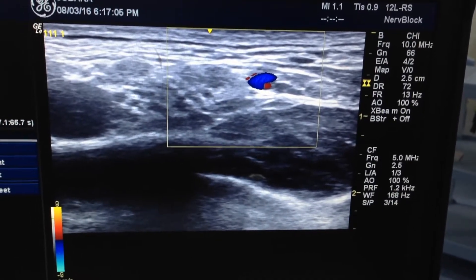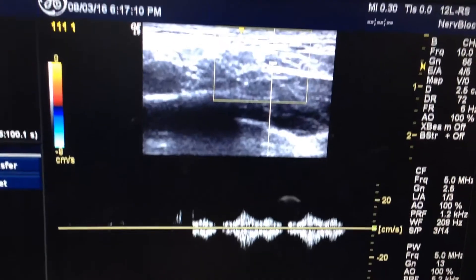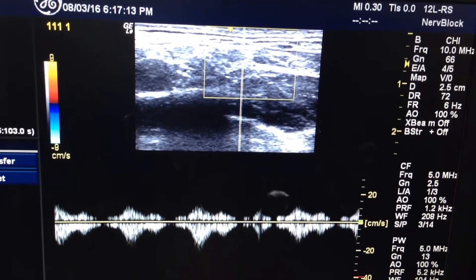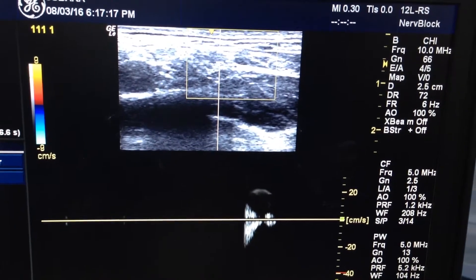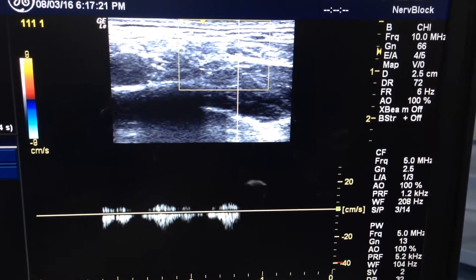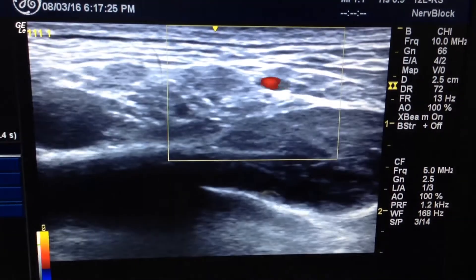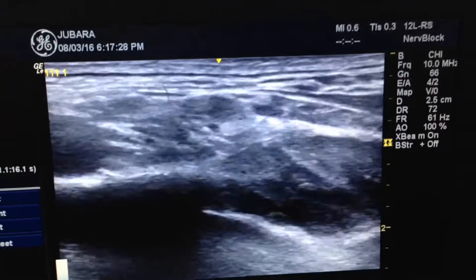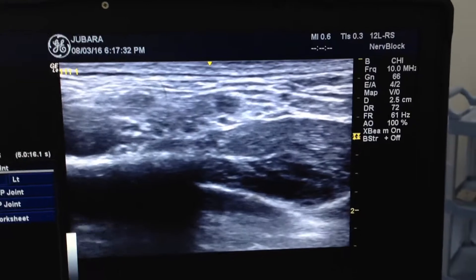I go to the Doppler. If I go just immediately to the trunk, one of the trunks has the same shape — see it is flat. It takes the same shape of the trunk, and with mild compression it is still pulsating.